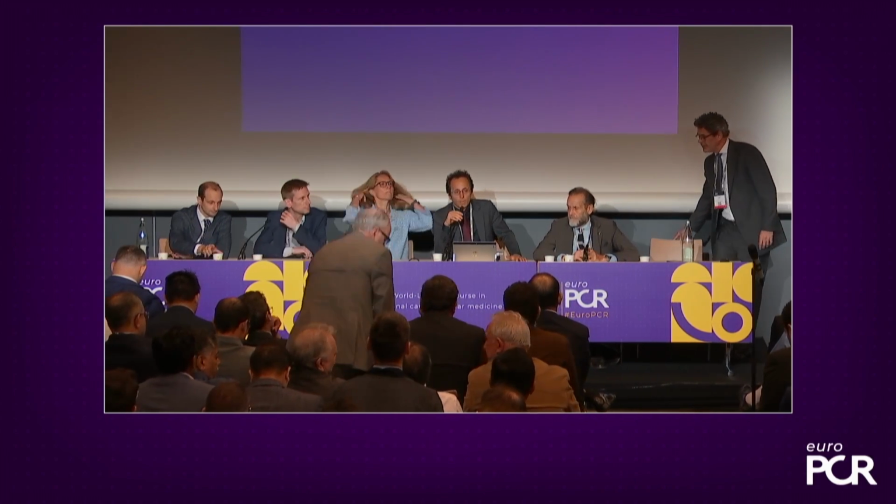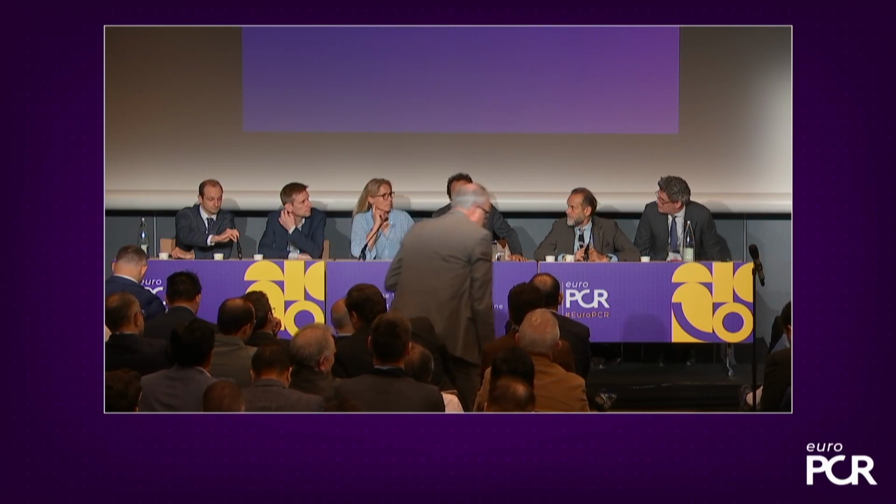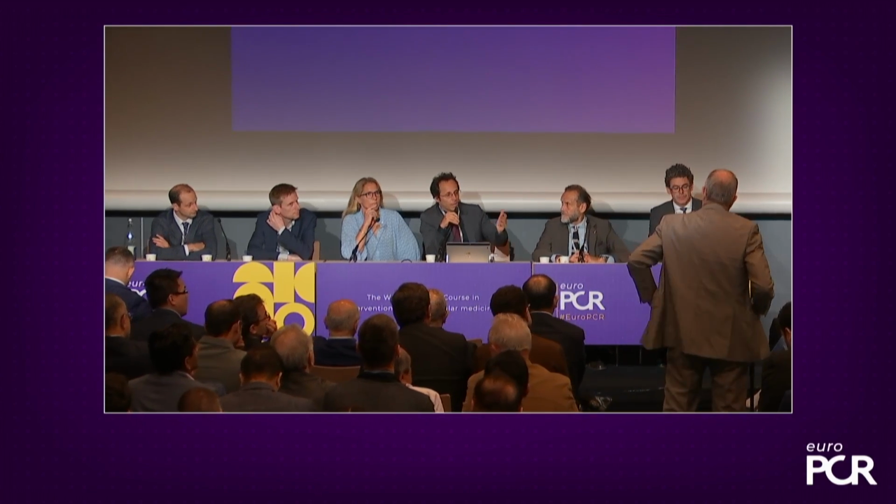I mean, this was really a fascinating case, really based on the fact, Jonathan, that you modified eccentric calcified plaque. So can you predict that nowadays? I mean, or in how many percentage does it work? I mean, we've seen beautiful microfractures, and we have seen a beautiful MSA, and those are cases where in the past we had recoil. Actually, we didn't know what to do, right?